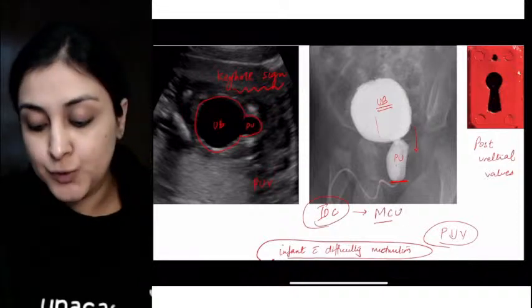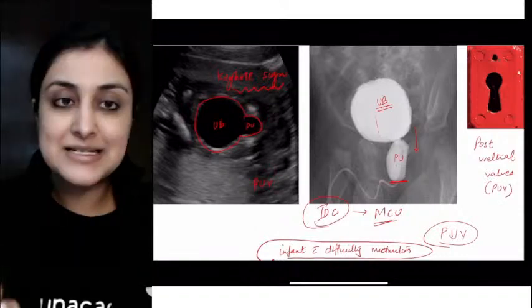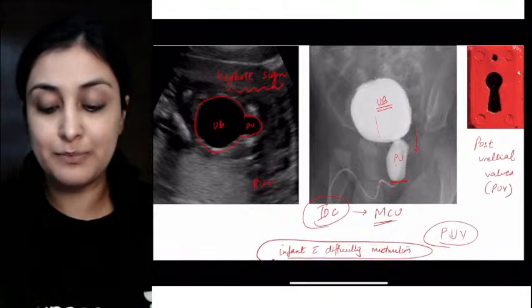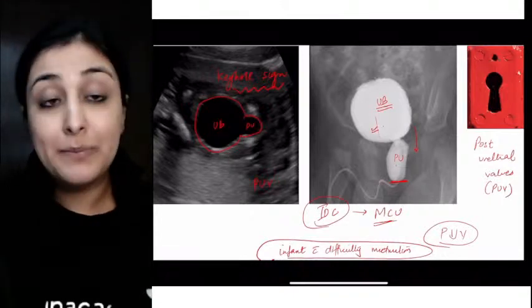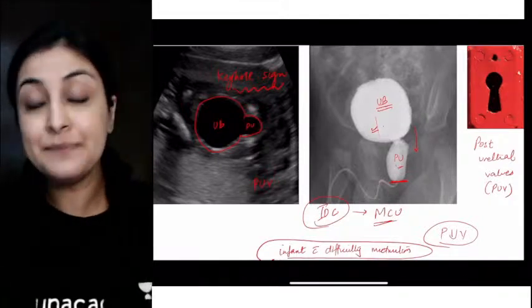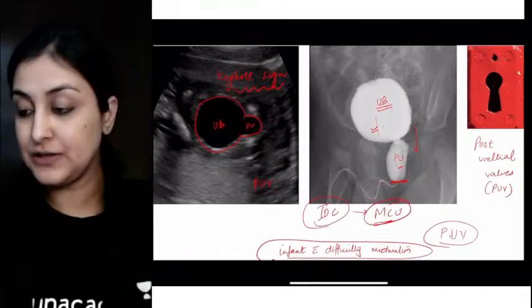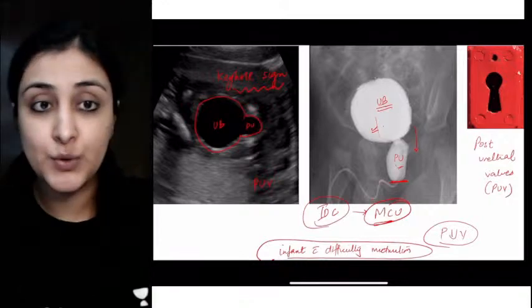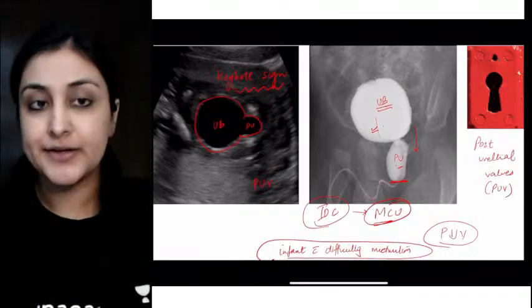What is the investigation of choice? We will do an MCU. Three letter condition, three letter investigation. Micturating cystourethrography. The baby will void and we will see the bladder is dilated, posterior urethra is dilated, but this anterior urethra is very narrow. This is what we see in posterior urethral valve. Keyhole sign on ultrasound, investigation of choice micturating cystourethrography.